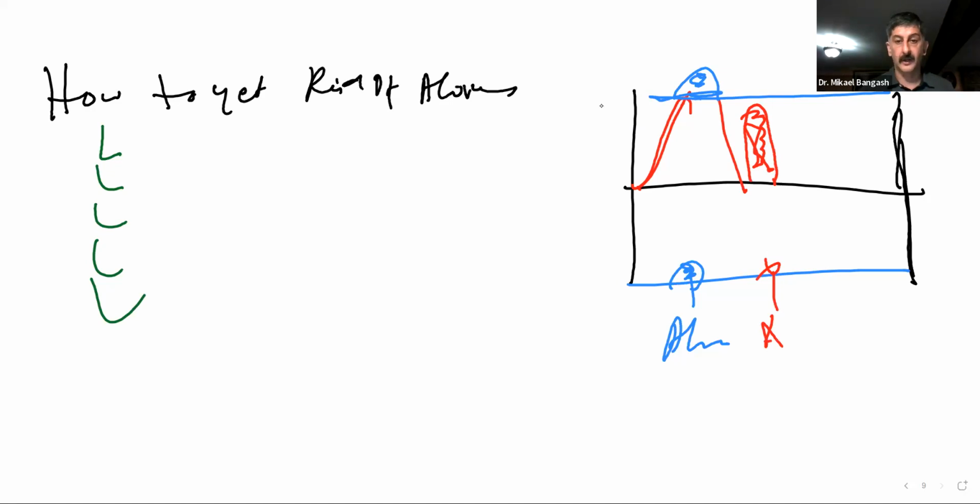Or, for instance, if you had a negative Doppler shift, and that was aliasing, how are we going to be able to just record that negative Doppler shift without aliasing?